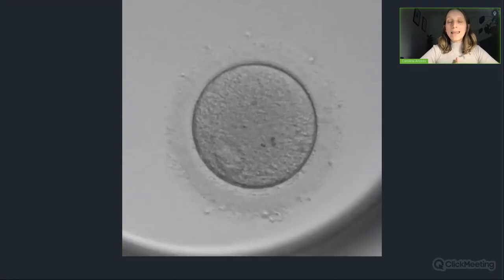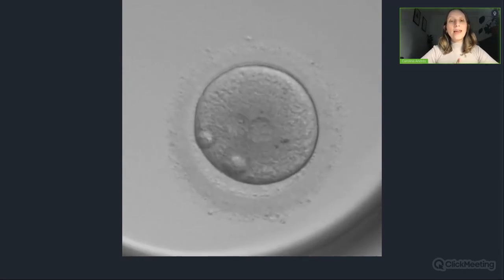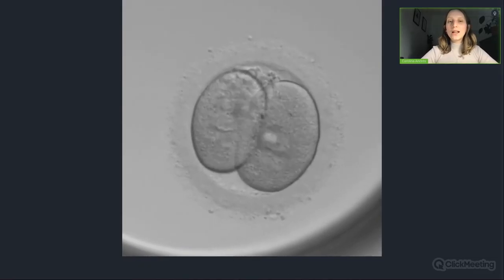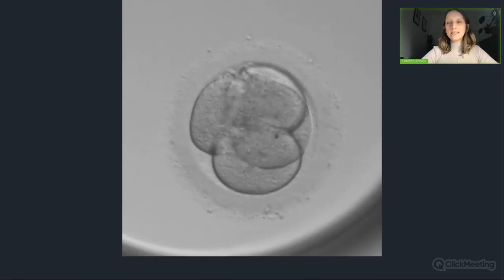But as you know, the culture has been greatly optimized, and nowadays we can cultivate until day 6. So in this video, which is sped up, you can see how the embryo will divide into 2 cells, 4 cells, 8 cells, towards the blastocyst.